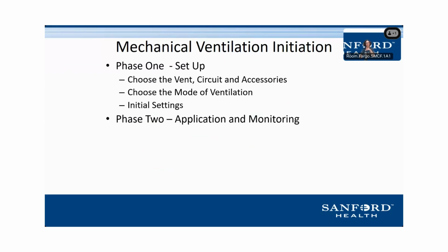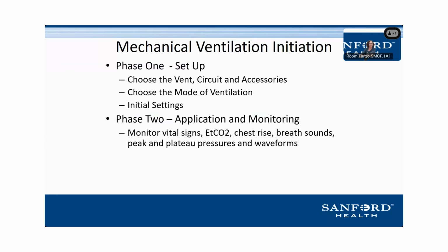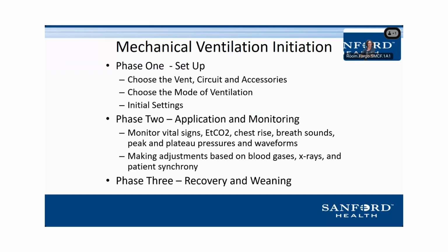Phase 2, once we get the patient on, we're going to do some monitoring, look at some of the feedback we're getting from the ventilator and what our patient looks like on that machine. So today we're going to focus more on initial settings and our monitoring of the patient and what it looks like. But then, yes, eventually you'll get to phase 3, which is recovery and weaning, and that weaning process.